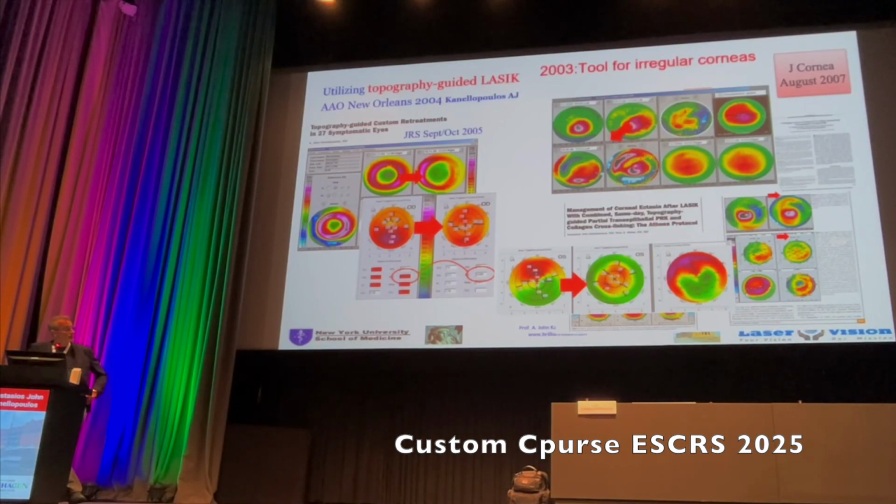You can see here the laser ablation. This is putting minimal refraction. This is him before, after, and the difference in the corneal topography at 3 months. And we lost him after that. He was very happy. His vision was 20/20, lost.